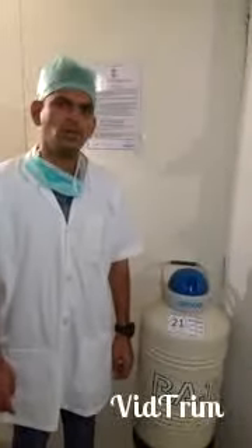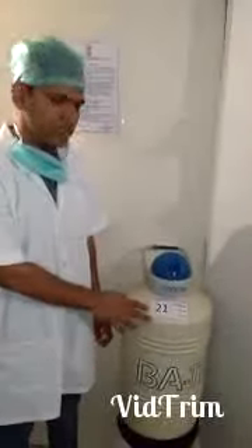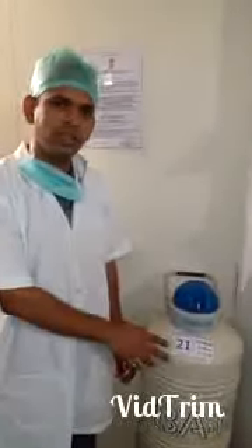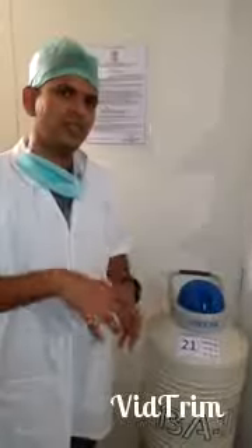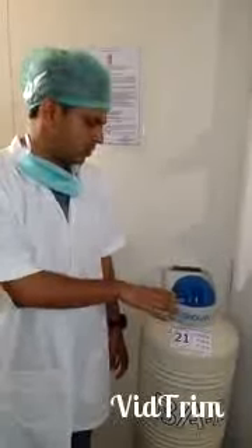Hello, in today's video, I am going to give you an idea about cryocans. Cryocans are basically liquid nitrogen containers in which we preserve frozen embryos, eggs and sperms. We usually fill up cryocans with liquid nitrogen. The temperature of liquid nitrogen is minus 196 degrees Celsius.